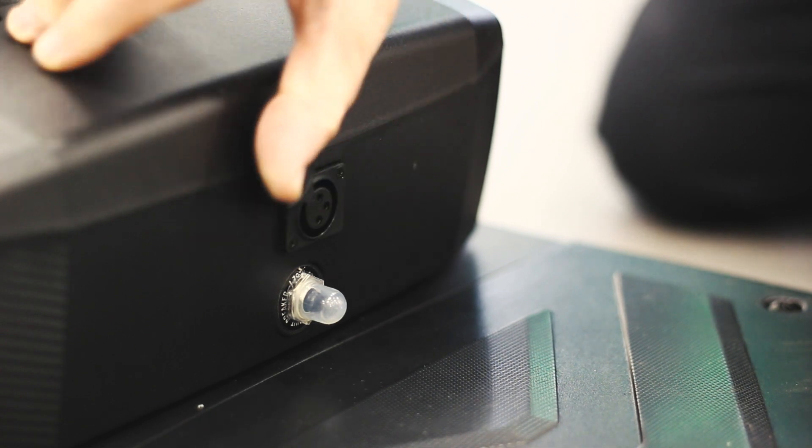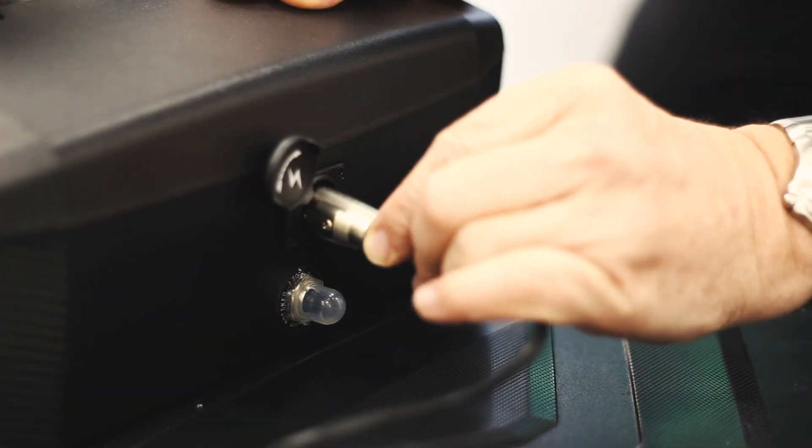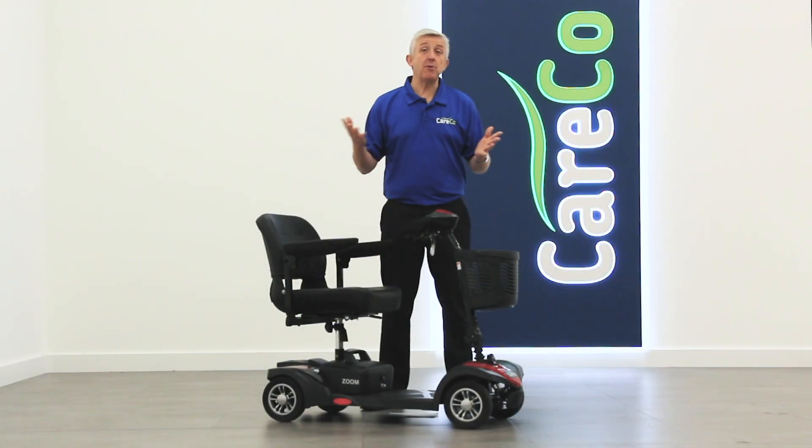To insert the charger, just move the cover and connect the charger, taking care not to damage the pins.